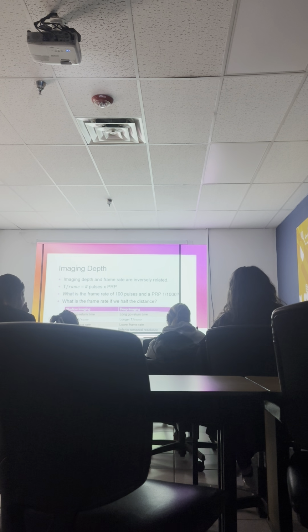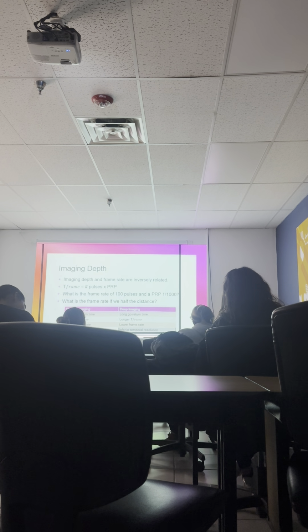Okay, so T-frame, the time it takes to make 1 frame. T-frame is equal to the number of pulses times the PRP. So if we increase the pulses, what happens to our T-frame? It goes up. The time for the T-frame goes up, which means what for our frame rate? It goes down, because T-frame and frame rate are inversely related.